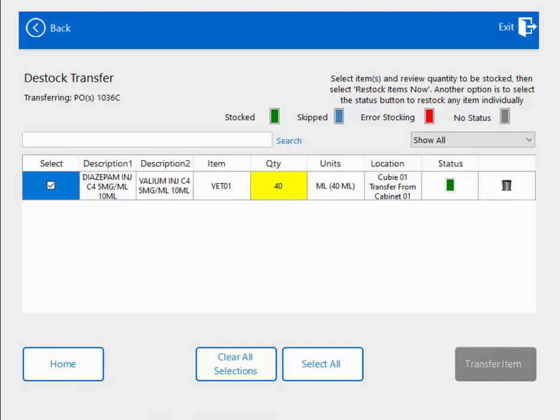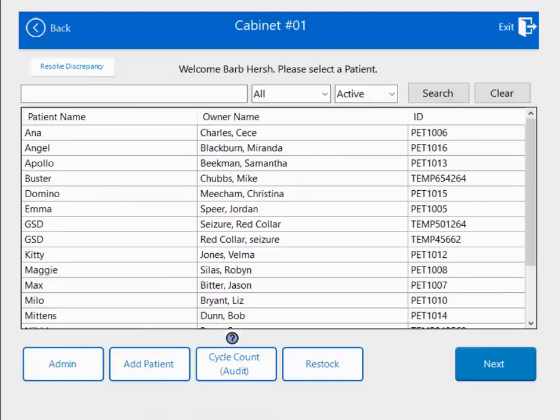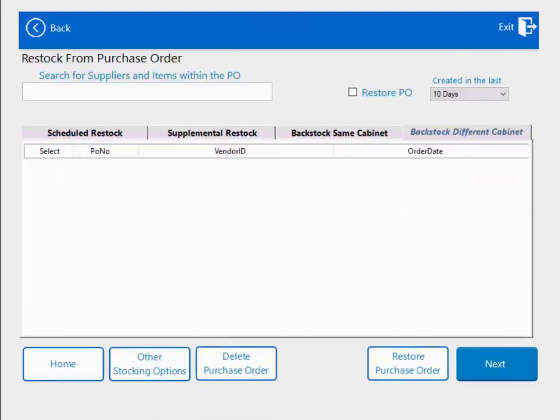Now let's walk through what a transfer between two different Qubex cabinets would look like. From restock, hit home, hit restock, and this time select backstock different cabinet. I don't have a different cabinet in my system, but if I did and there was a purchase order generated, it would be sitting here. The only difference between backstock different cabinet and backstock same cabinet is that in the same cabinet, it takes you to the backstock, has you remove the bottles, then goes directly to the active stock to replenish. With a different cabinet, you would de-stock the bottles from the backstock matrix drawer, then exit to the other cabinet, log in, click restock, hit backstock different cabinet, and that purchase order would be waiting there to have you replenish those items into the active stock of that cabinet.